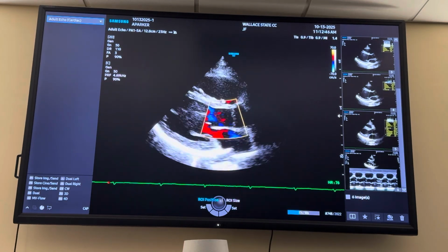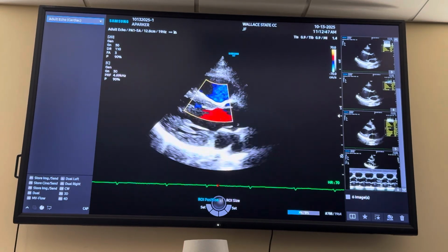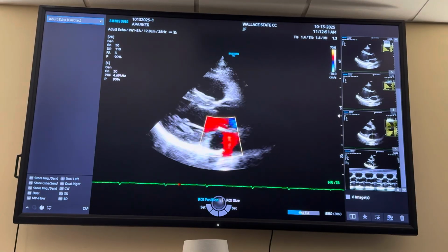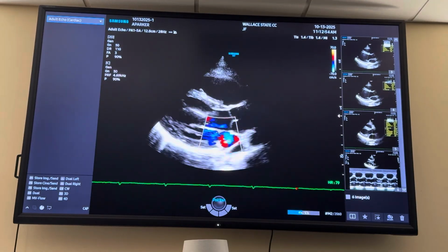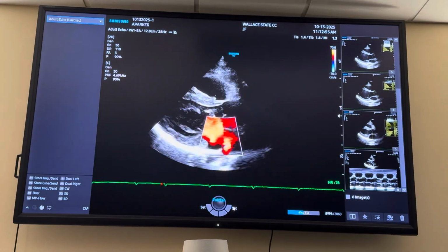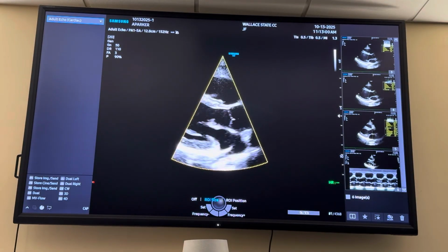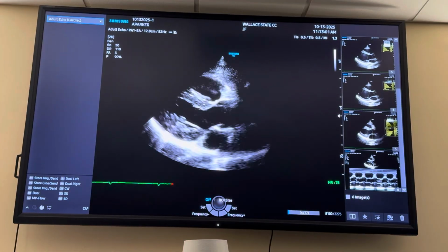So I'm sure on every machine you can adjust the color box around the trackball. If you look on the bottom of the screen up there, you can see it'll say on there size, color box, whatever. It says ROI size. Oh no, anyways, I'm over here playing. I'm messing up.